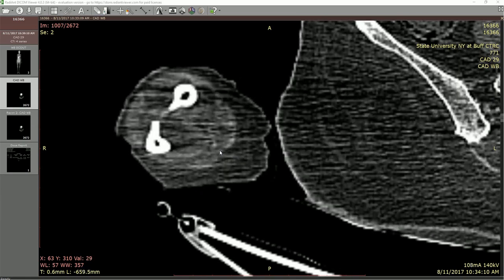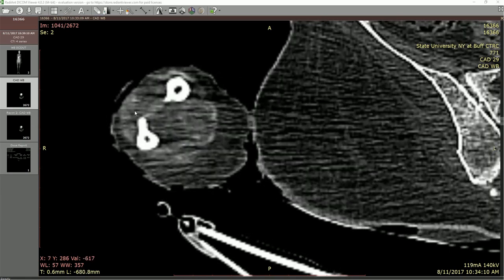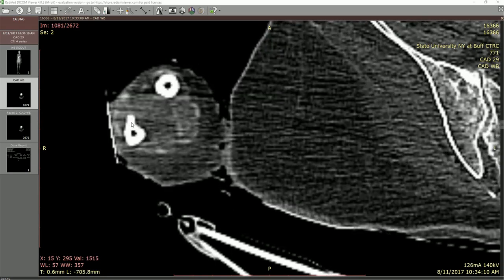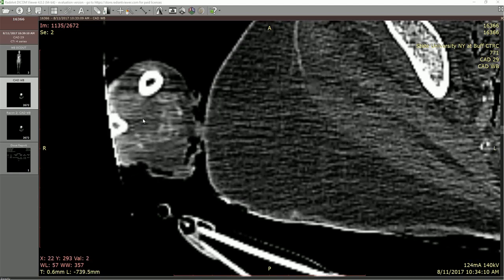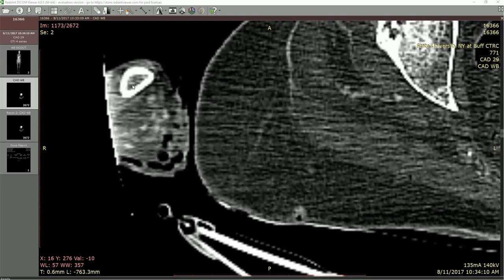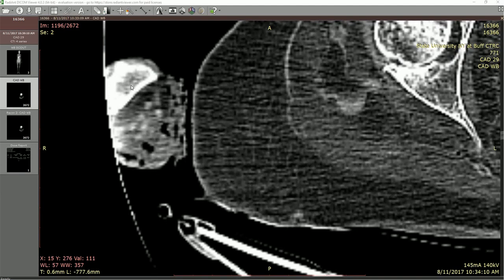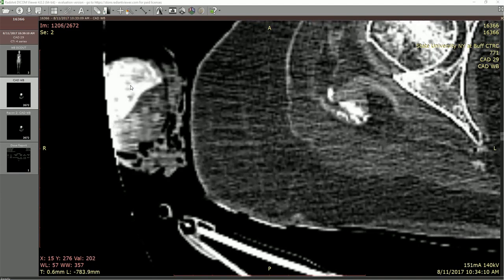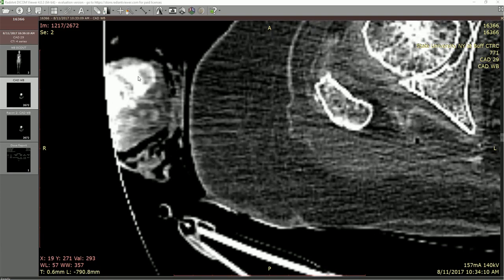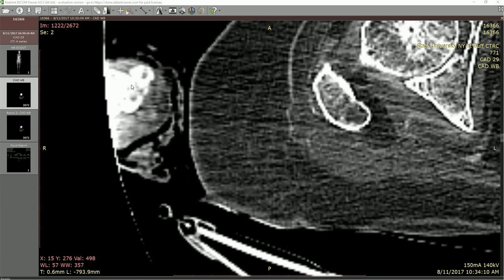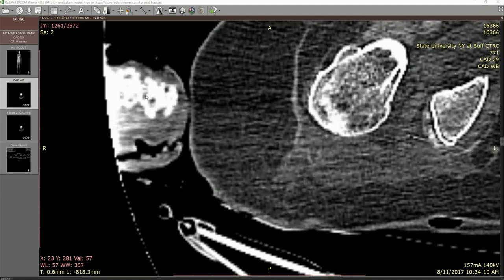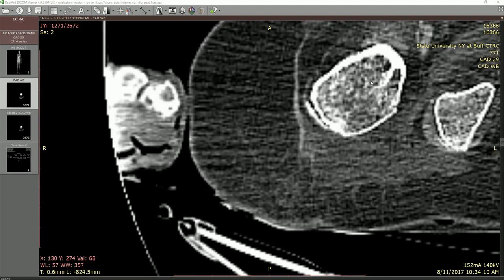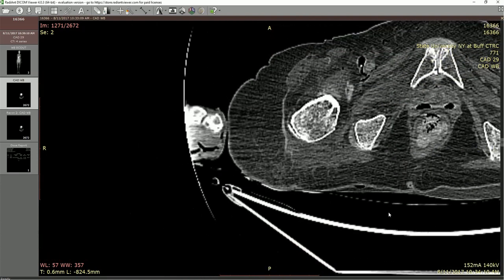Continuing to move down, this is where we see it venture out to the side making it more difficult to identify. The anterior compartment would contain the long flexor tendons; the posterior compartment with the extensor tendons. As it starts to scroll off the screen, we can see the end of the ulna. This takes us into the terminal portion of the ulna and we're into the wrist region. Unfortunately, because we're so far out, the signal gets lost. We can't do a good job with the carpal bones — these would be the metacarpals — but that's where we lose perspective.